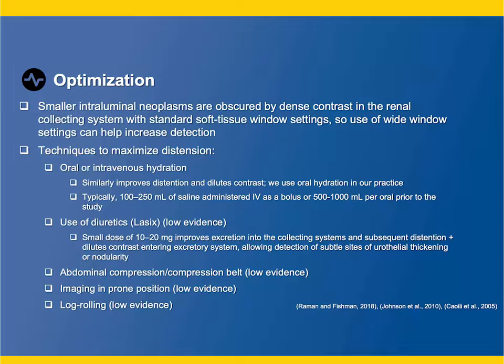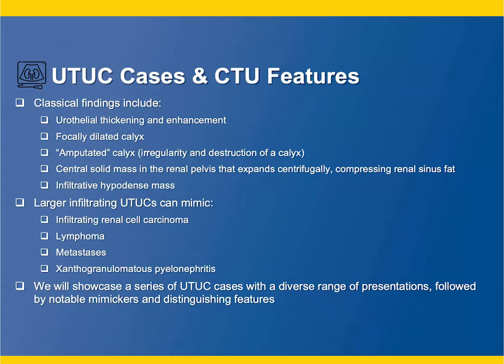Remember, for a while, particularly the institutions in Boston, were recommending Lasix when you were doing CT of the kidneys. We don't do that. We don't do compression. We don't do prone position. We don't do log rolling. All of these things have come out over time, and they never really caught on.